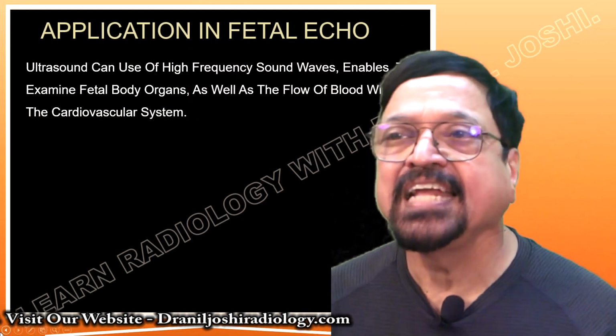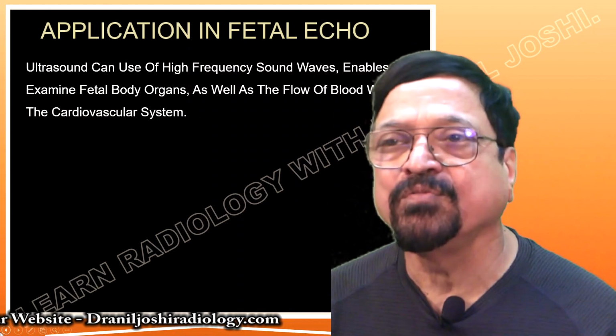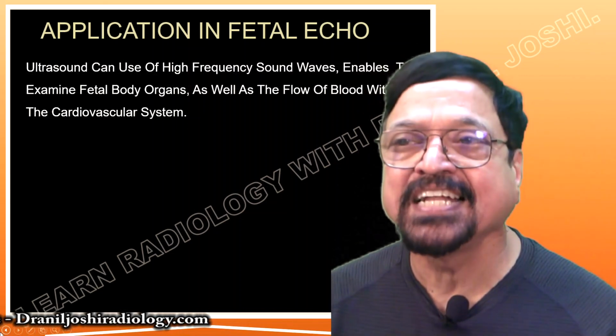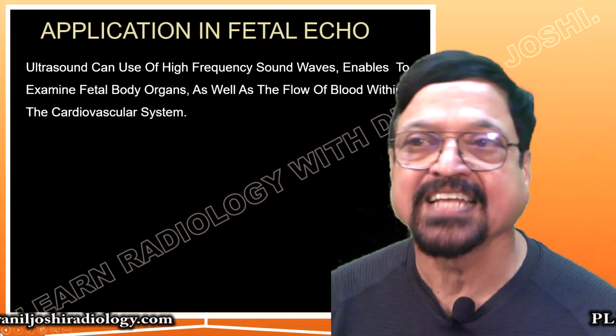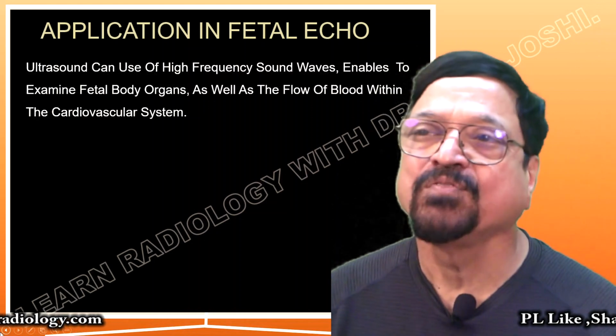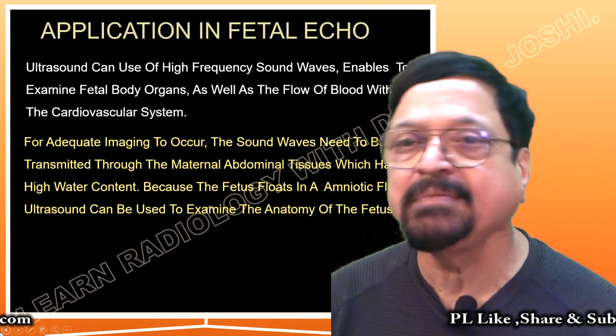Now the application in fetal echography is the same as what we have seen just now. The only difference is you have to use a high frequency ultrasound, because the fetal heart rate is high. It enables us to examine the fetal body organs also, as well as the flow of blood within the cardiovascular system. This is the application and combination of the same technology.